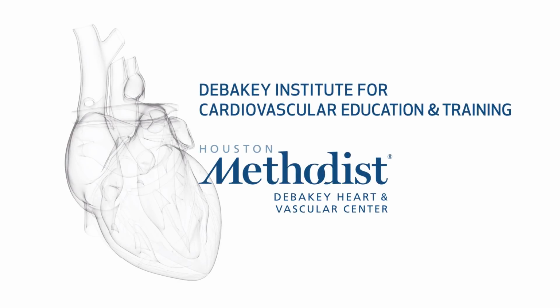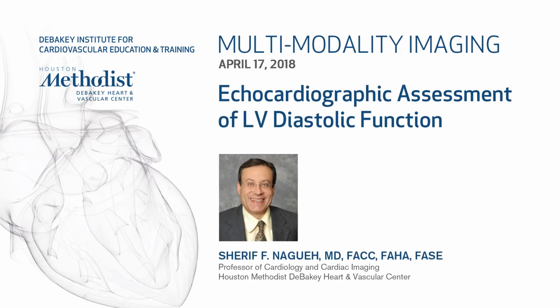Used today for diastolic function. I don't have that set of slides with me here. So we'll start with this one.